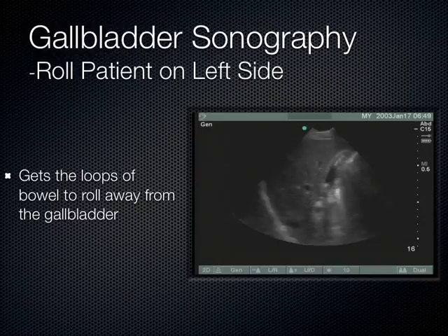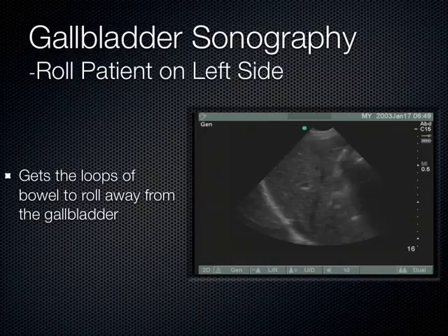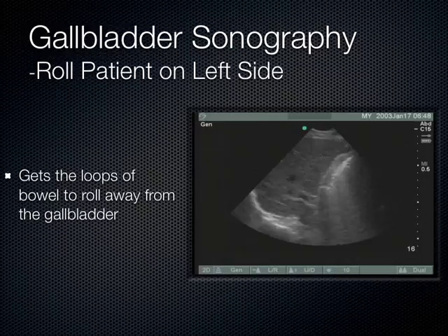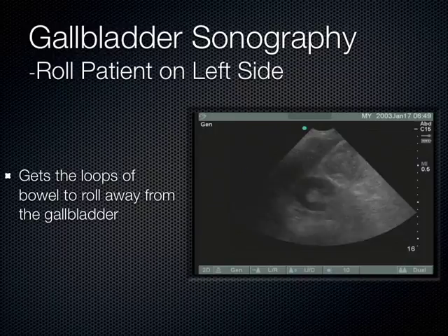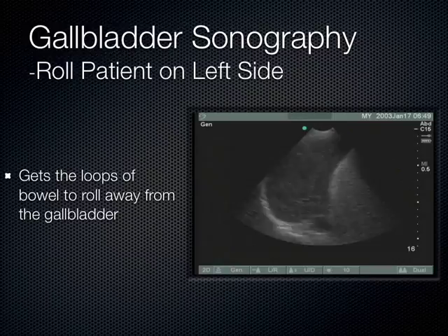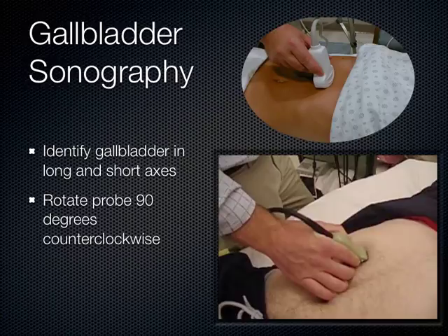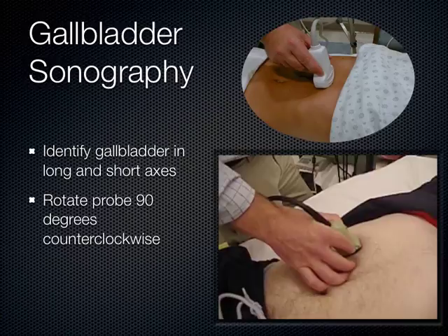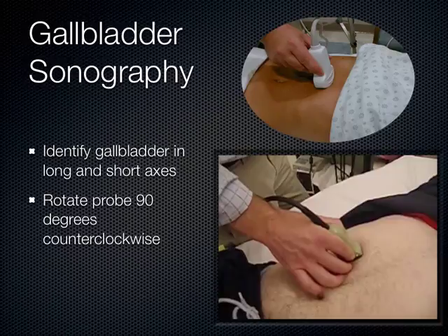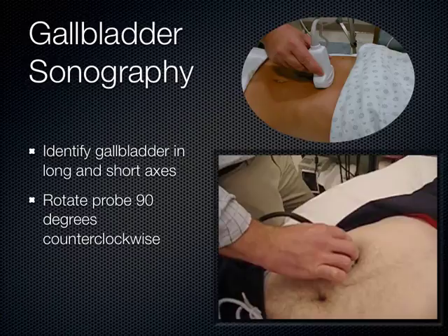This is a prior ultrasound fellow, Will Scruggs, showing the technique to scan the gallbladder. Once you identify the gallbladder in the long axis, you also need to view it in the short axis. Fan through the entire gallbladder in long axis looking for pathology. After you're done with the long axis, rotate the probe 90 degrees and view in the short axis, again fanning through the entirety of the gallbladder looking for any possible pathology.